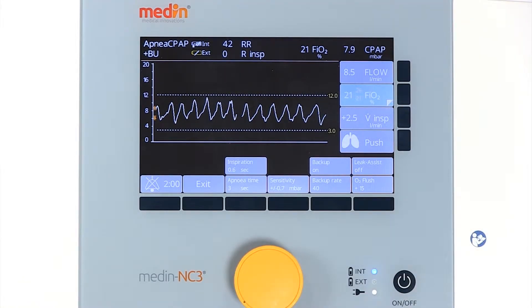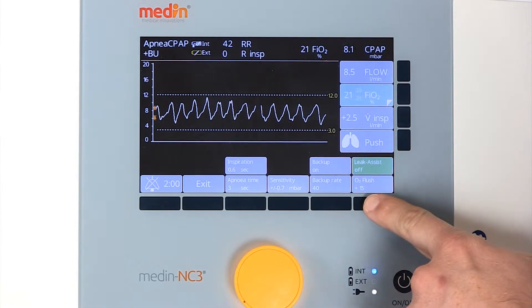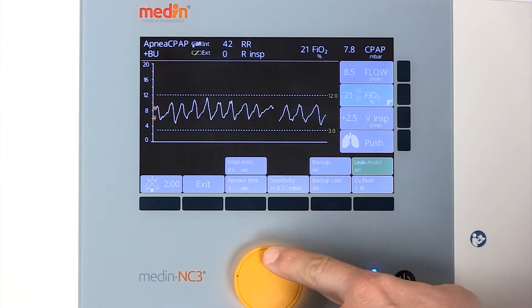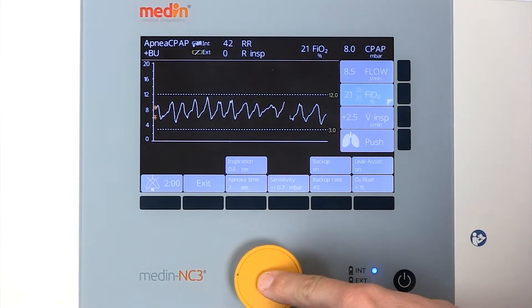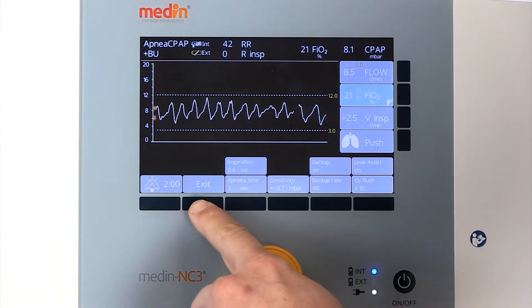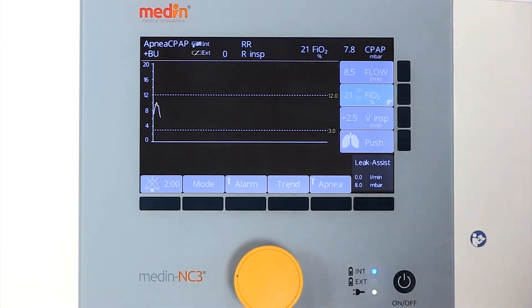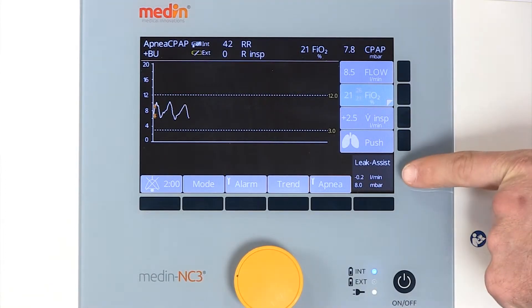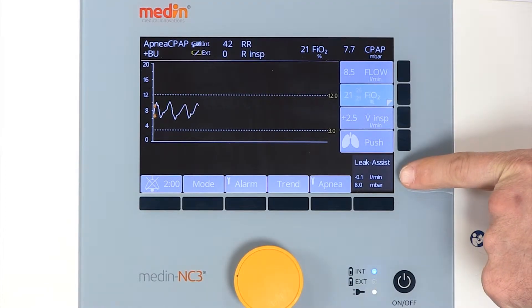The leak assist function for automatic leak compensation can be activated if required. When leak assist is activated, the current CPAP pressure is saved as a target pressure.